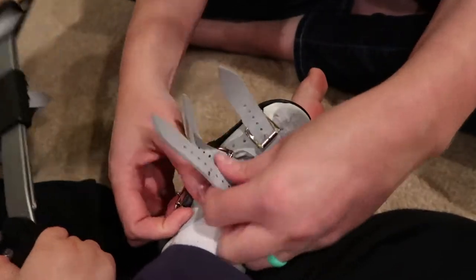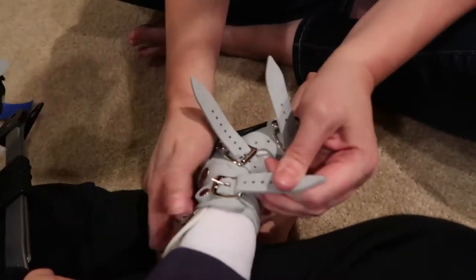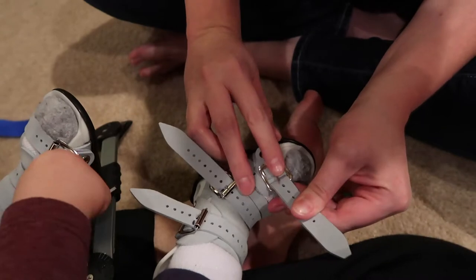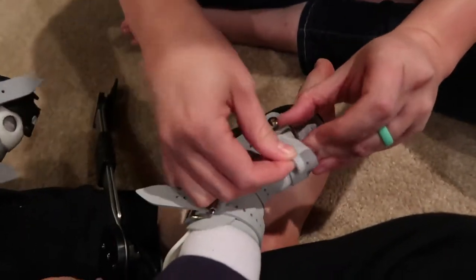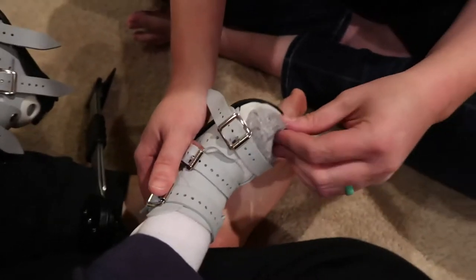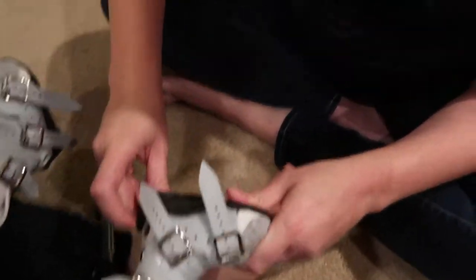I can see I should tighten this one more notch, so I'll go back and tighten it, then buckle, and check the sock. Then check the heel to make sure it's in the back.